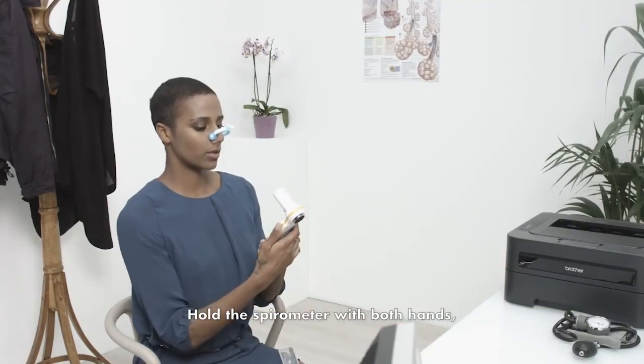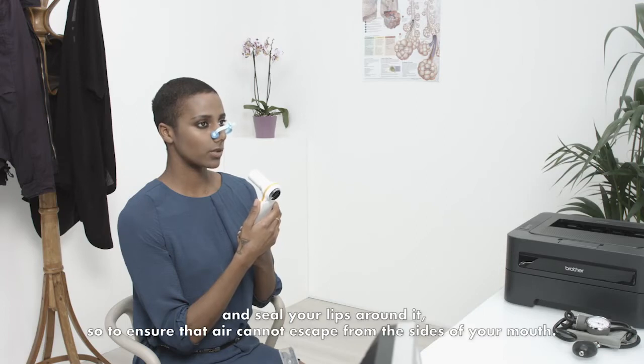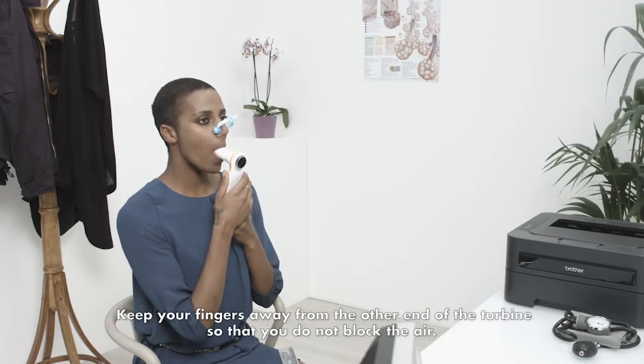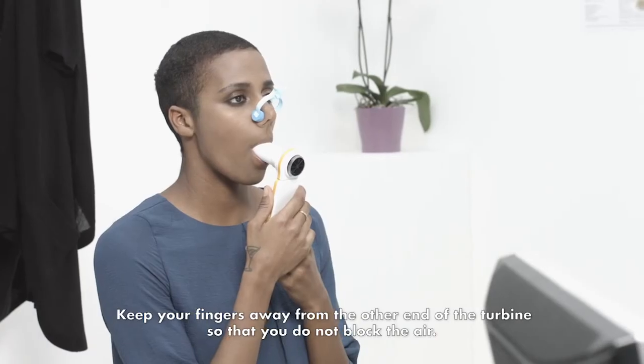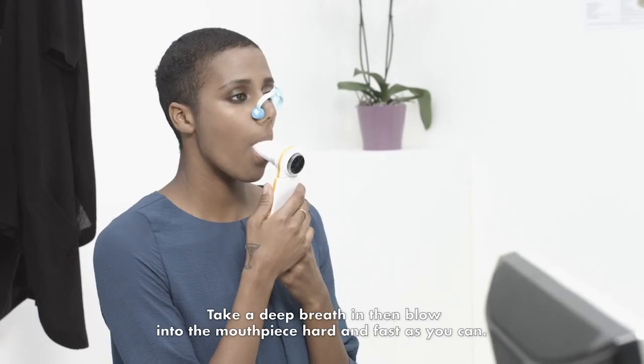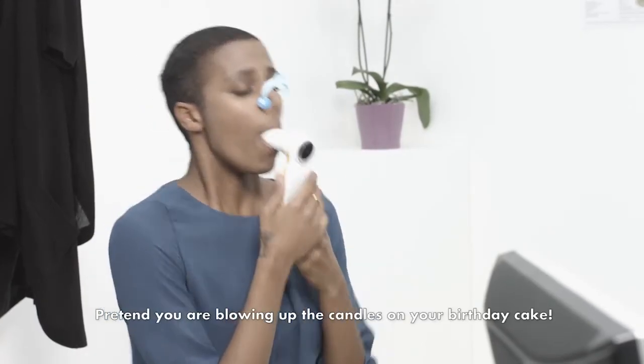Hold the spirometer with both hands. Make sure your mouthpiece is inserted well into your mouth beyond the teeth, and seal your lips around it, so to ensure that air cannot escape from the sides of your mouth. Keep your fingers away from the other end of the turbine so that you do not block the air. Take a deep breath in, then blow into the mouthpiece hard and as fast as you can.